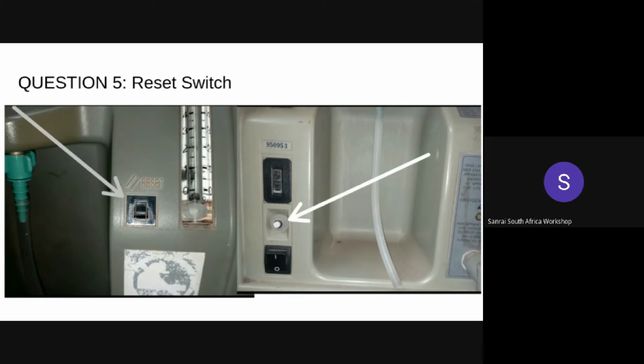Short circuits in any electric connection, for instance, on the control circuit board, in the internal compressor winding, or any electrical component inside the oxygen concentrator, also cause the reset switch to trip. This occurs when the current finds a way to bypass the appliance on a path that has little or no resistance. In addition to the factors mentioned above, the reset switch will also keep on tripping when it is faulty.